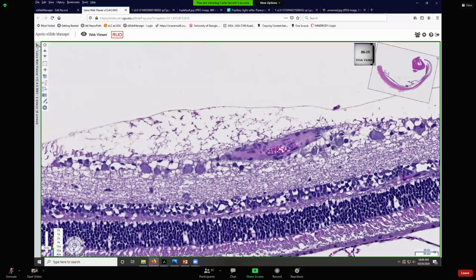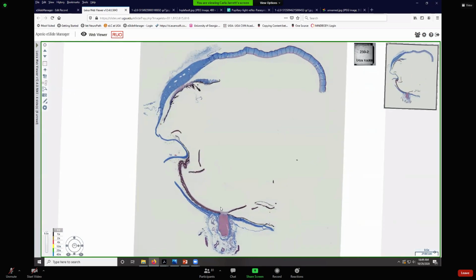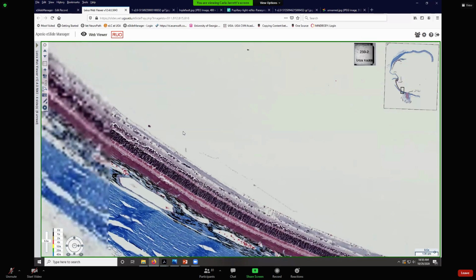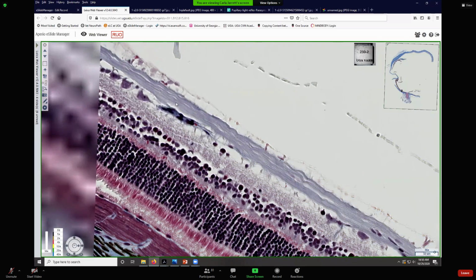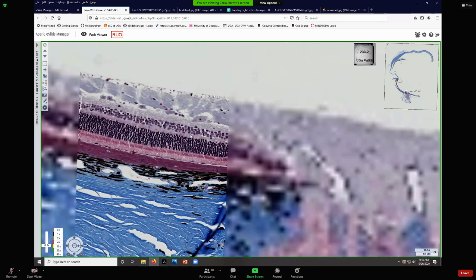And what happens to all of those axons? Well, I'm really glad you asked. So let's take a look here, and I'm going to rotate this. And this is the carnivore eye. And here you can see these axons of the ganglion cells starting to coalesce right here. So here's our ganglion cells. Here's their axons. And this axonal layer is getting thicker and thicker and thicker as we move back towards the posterior portion of the globe. What's going to happen?